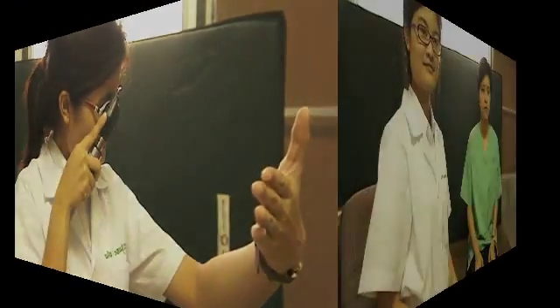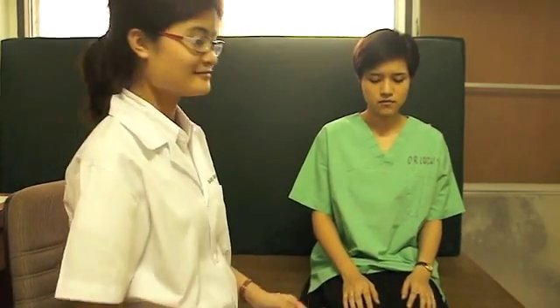ตรวจในห้องมืดเพื่อให้รูม่านตาขยาย นั่งในระดับเดียวกับผู้ป่วย หันหน้าเข้าหากัน เข้าทางขวาเมื่อจะตรวจตาขวา มองไปที่ระยะไกลระดับซ้ายตา ถือ Direct Ophthalmoscope ด้วยมือขวา (Examine in a dark room so the pupil dilates. Sit at the same level as the patient, facing each other. Approach from the right to examine the right eye. Patient looks into the distance at left-eye level. Hold the scope with the right hand.)